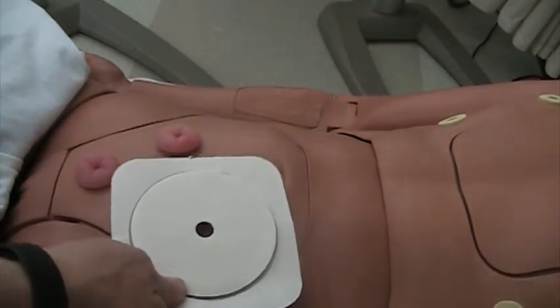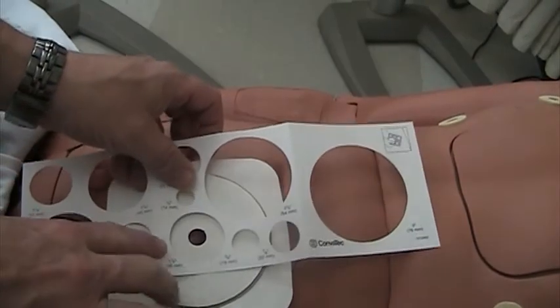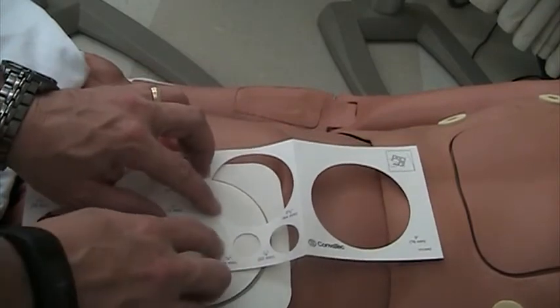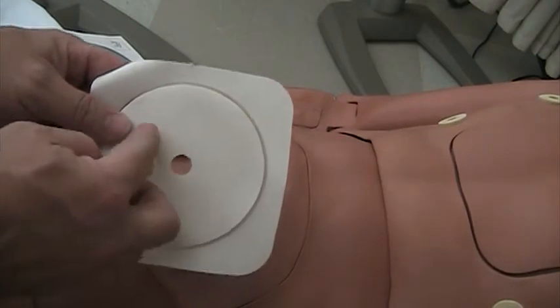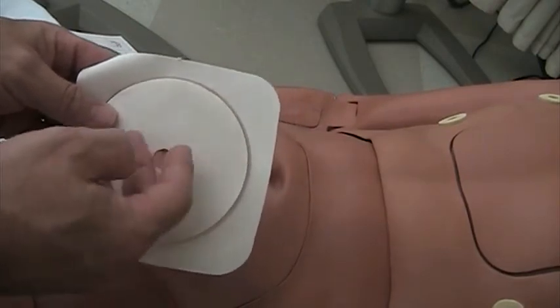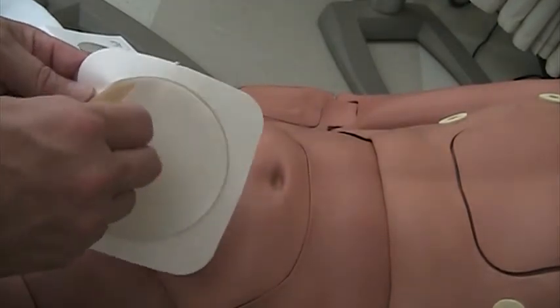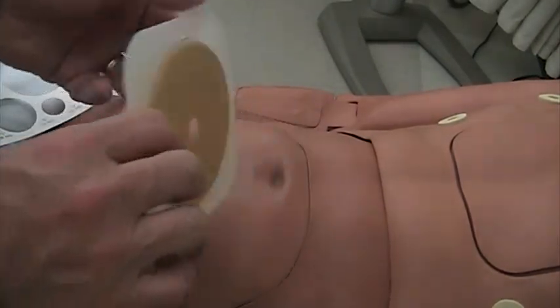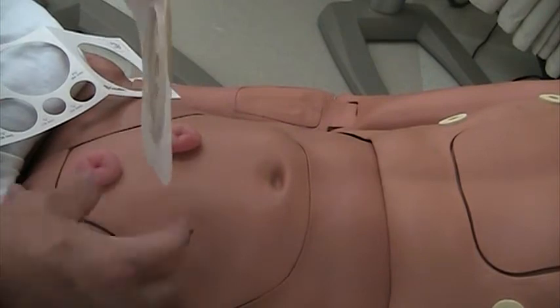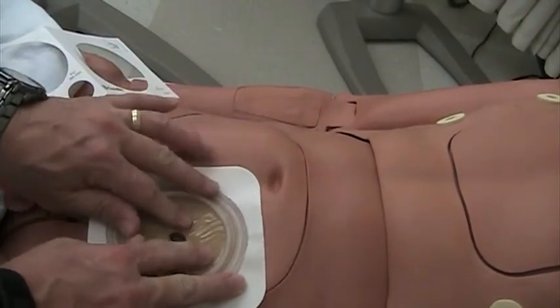I'm going to grab my wafer. Going to then take the size that I had and put it in the center, draw a circle here, and then I'm going to cut that hole out with a pair of scissors, regular scissors are fine. Then once I cut it out, I'm going to take this off. Turn it upside down. This is always patient side. It would fit over that stoma, and then it fits onto the patient.